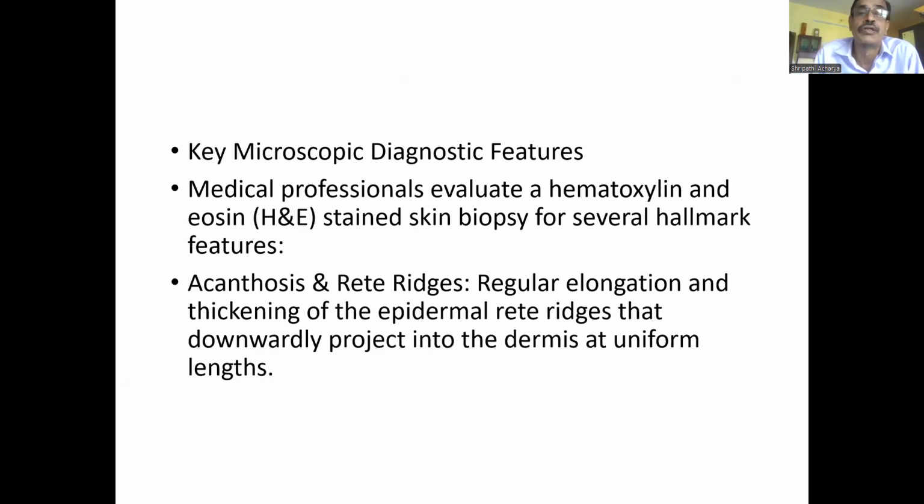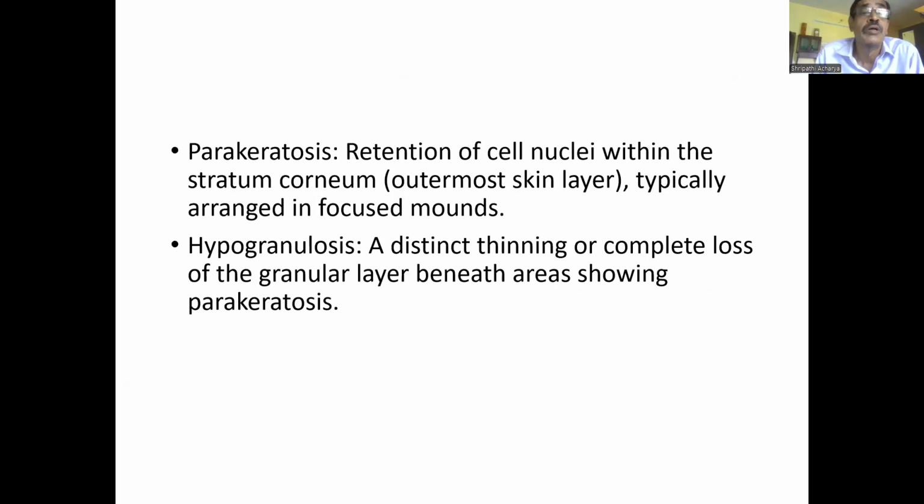Key microscopic diagnostic features. Medical professionals evaluate a hematoxylin and eosin stained skin biopsy for several hallmark features. Acanthosis and rete ridges. Regular elongation and thickening of the epidermal rete ridges that downwardly project into the dermis at uniform lengths. Parakeratosis. Retention of cell nuclei within the stratum corneum, the outermost skin layer, typically arranged in focal mounds.